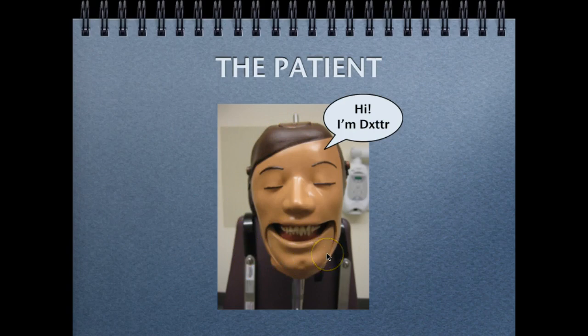And so they're very cooperative. They don't have saliva. They do have a big rubber tongue that sometimes you have to push out of the way. And they don't mind being irradiated. So you can practice with all course safety protocols on Dexter and get really good and be an expert before you work on a patient.